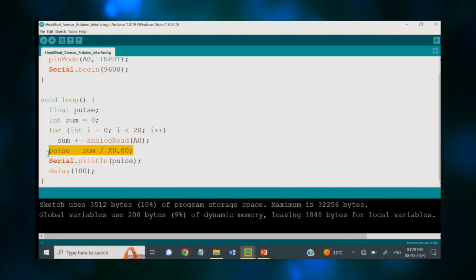So, while using this sensor, you always have to take care of how you press your finger on the sensor terminal, and we will definitely demonstrate that here. Within this for loop, I am updating my pulse with the sum of the previous 20 pulses to avoid the noise, and ultimately we are printing that on the serial monitor, or you can use the serial plotter here.